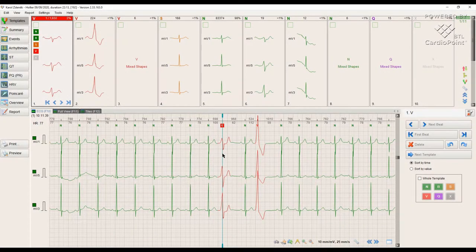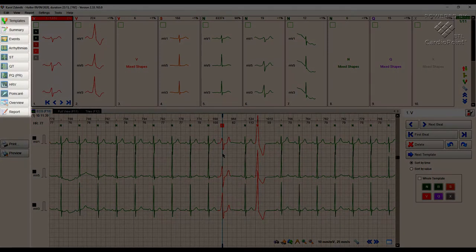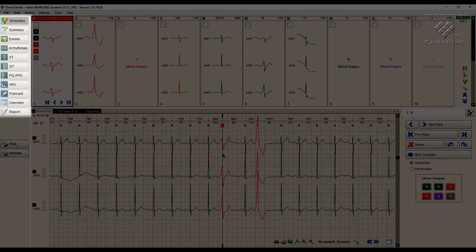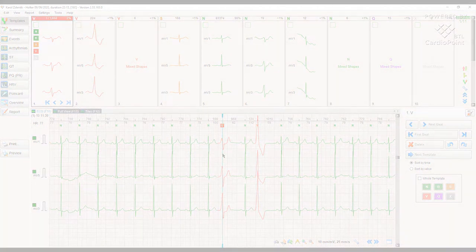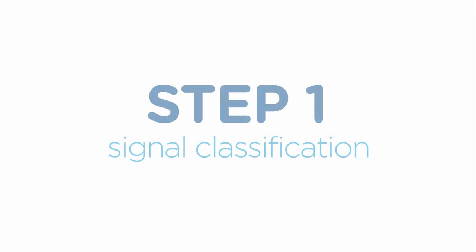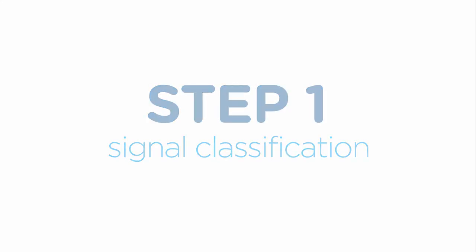Each button on this panel represents one module designed for a specific purpose. Let's start with the first step, signal classification.